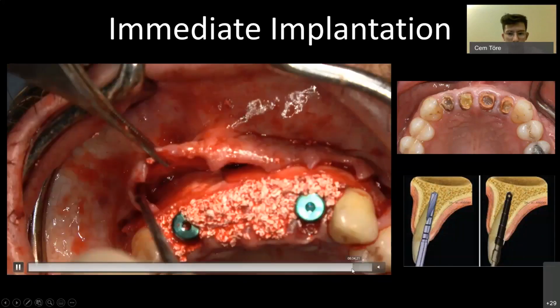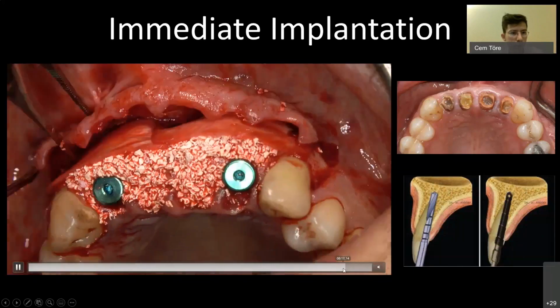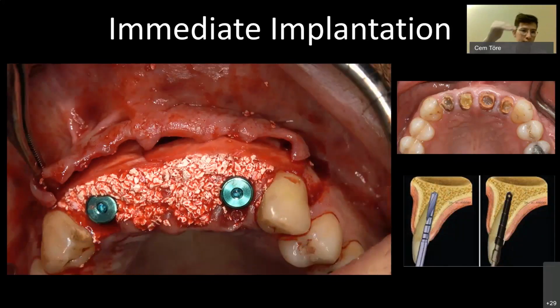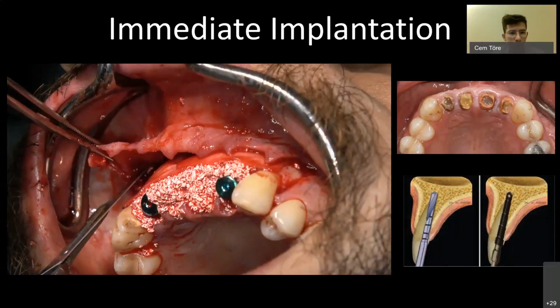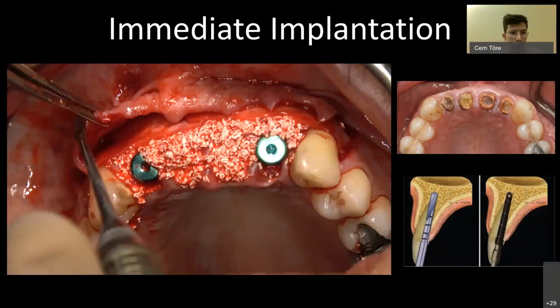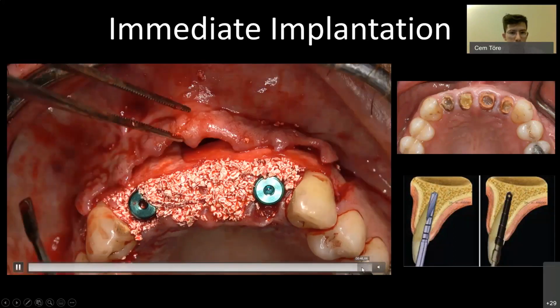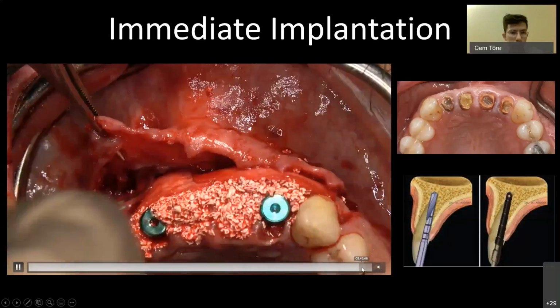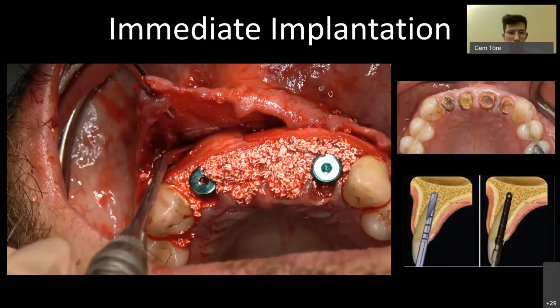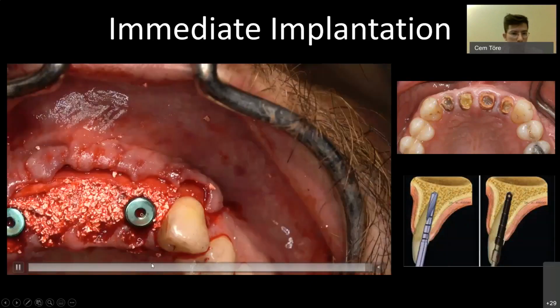Did you catch that? Watch here again. As soon as we make the incision, the whole flap just relaxes towards us. Right here. Boom. And now we can safely close that. We go again, checking in the middle. How much do we have? Just enough. Is good.